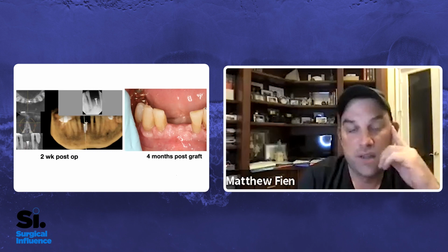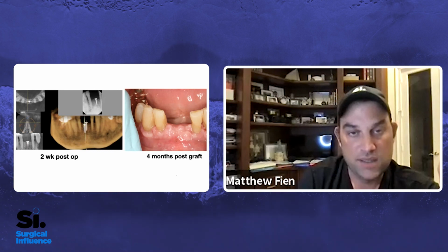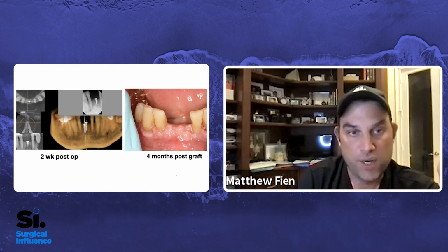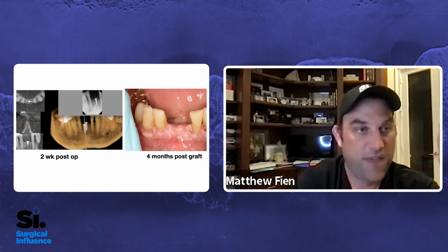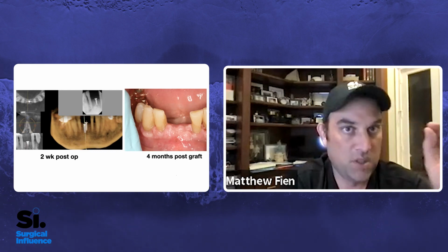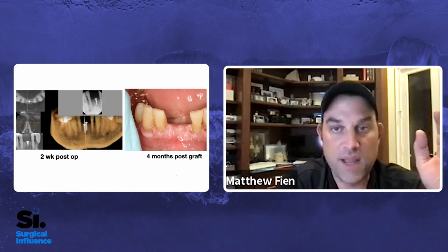All right, well, here's the last photo we have, but all signs point to us doing pretty well here. You can just kind of use the tenting screw as a reference point of that height of bone. So they're in a pretty nice shape. Now, one thing I'll say, it's a little tough. You're placing that tenting screw right in the center of that edentulous space. And the plan is to place one implant with a cantilever, which I think most of us would agree in this area of the mouth, great way to go. Just for aesthetic purposes, if nothing else.